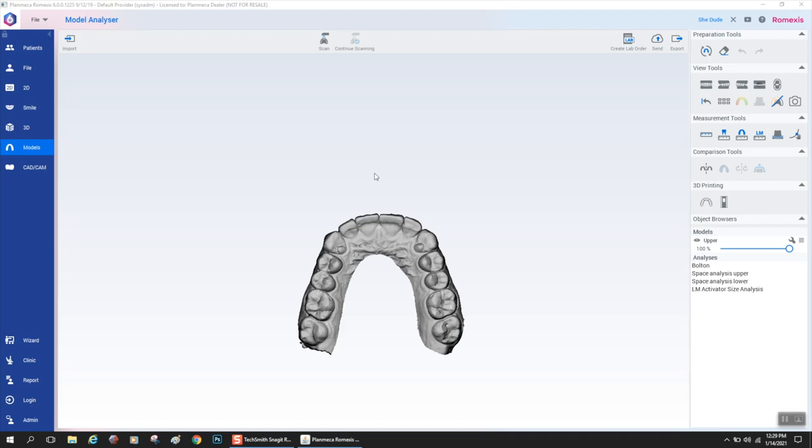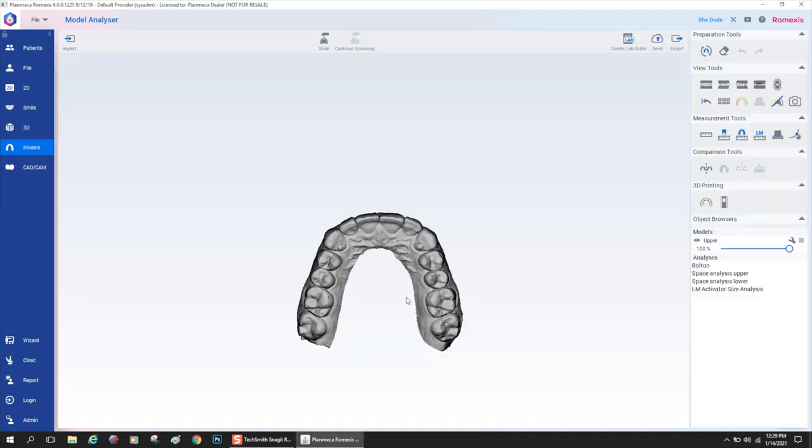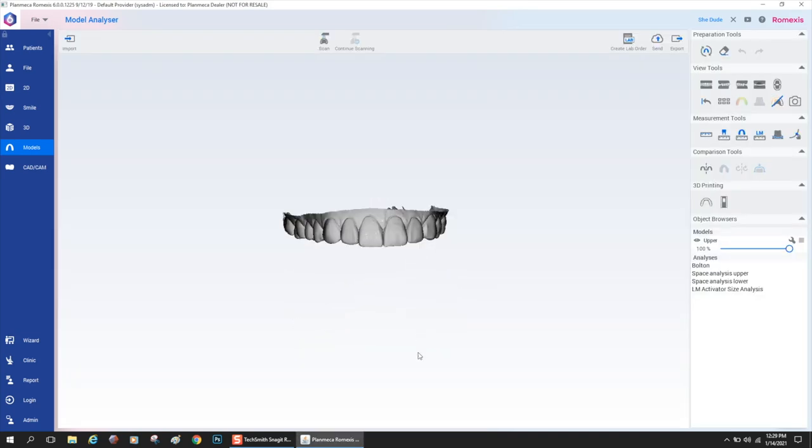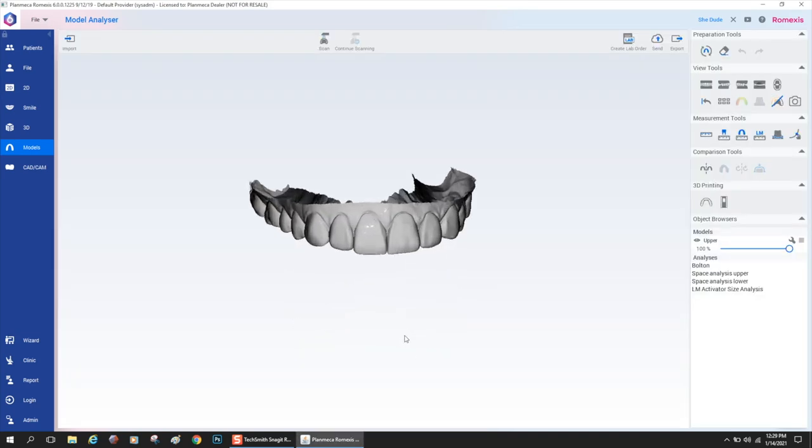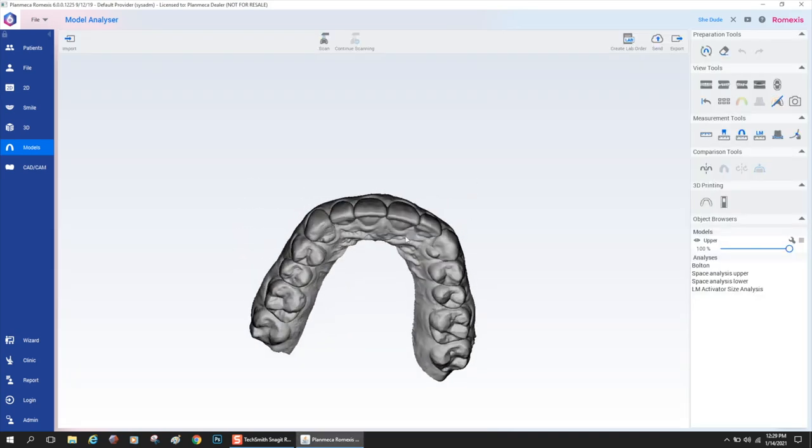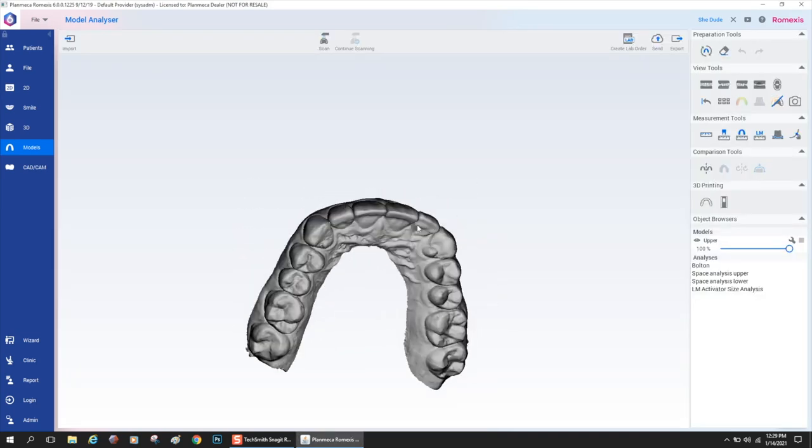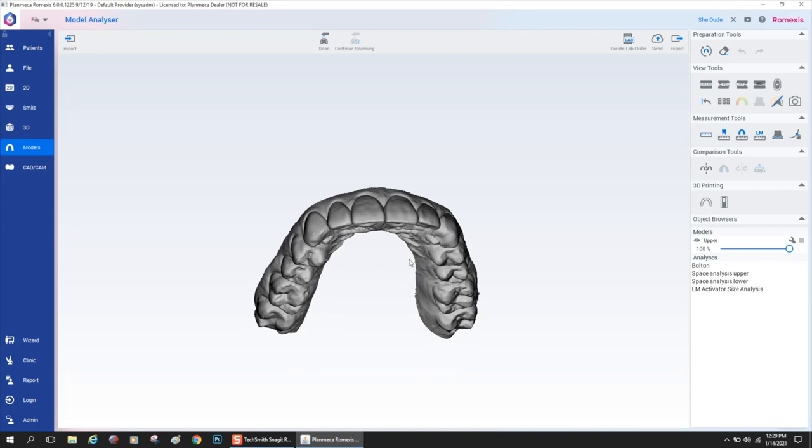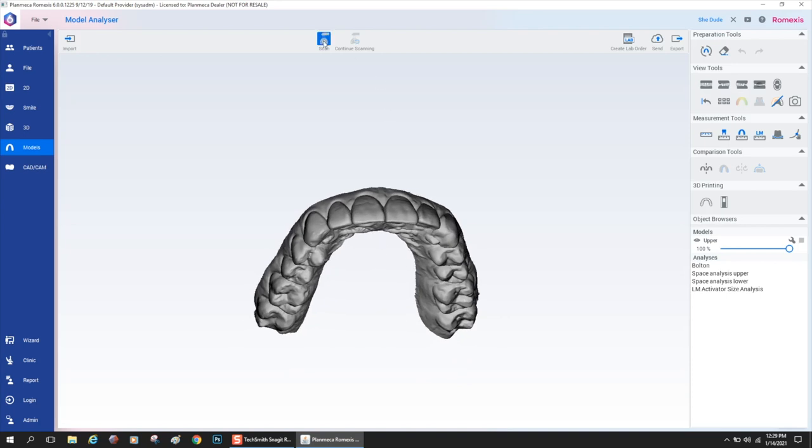And here you could see the case is ready, imported in and ready to be worked on. There are several things that you could do in model analyzer that we'll go into in just a minute.